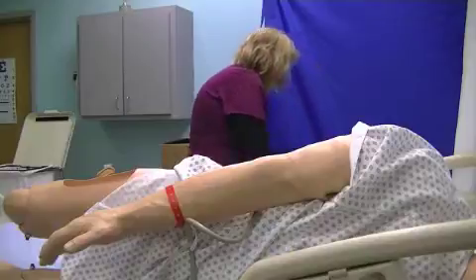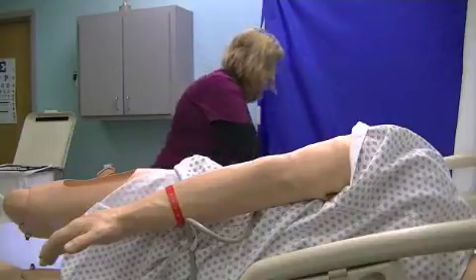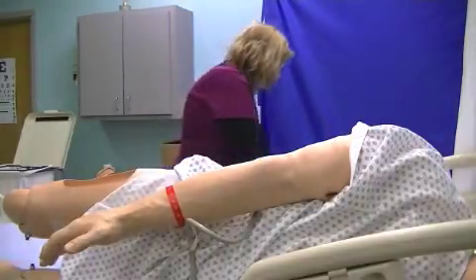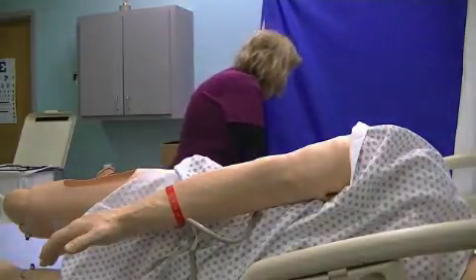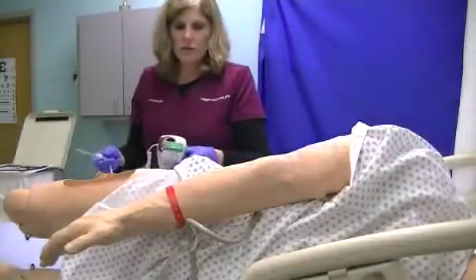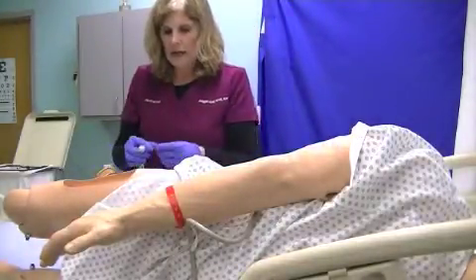I'm going to make sure I have a tissue handy so I can wipe this off when I'm done in the rectal area. I'm going to make sure I put a probe on here. I'm going to change this to the rectal setting, so make sure it's flashing.